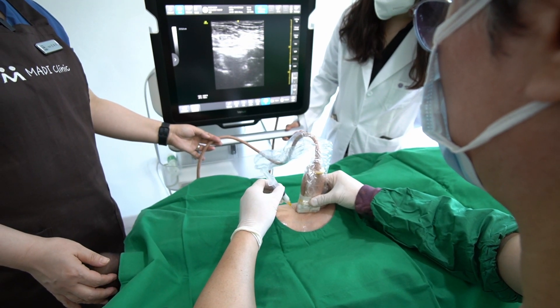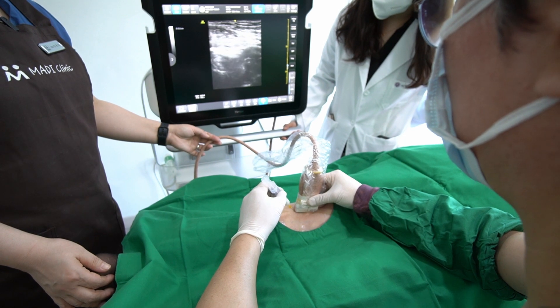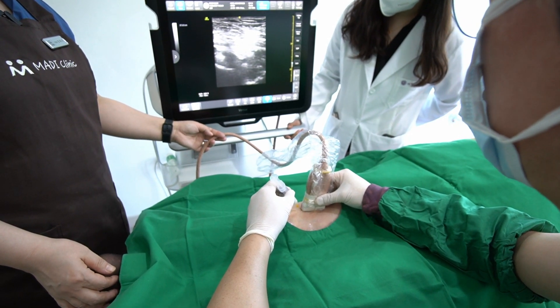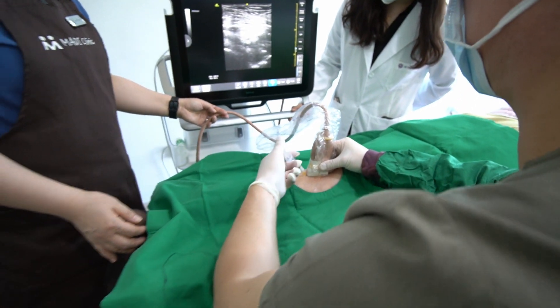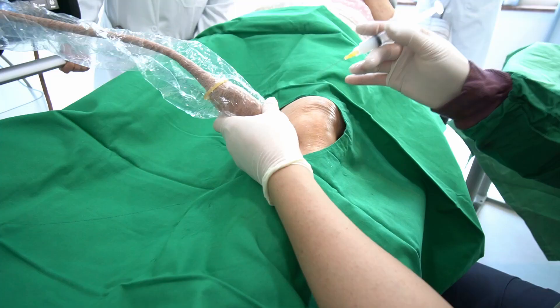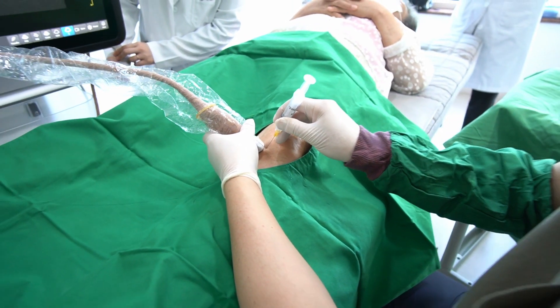As a right-handed practitioner, holding the ultrasound probe in your left hand and the needle in your right hand, two primary techniques are typically used: the horizontal approach, where the needle moves from right to left, and the vertical approach, where the needle moves away from your front towards the opposite side.